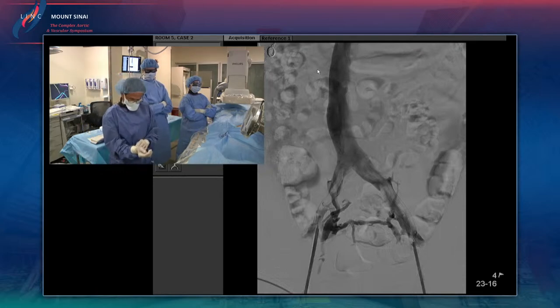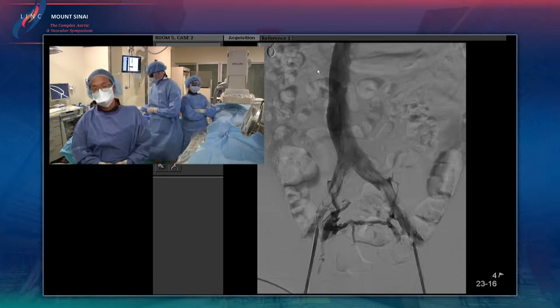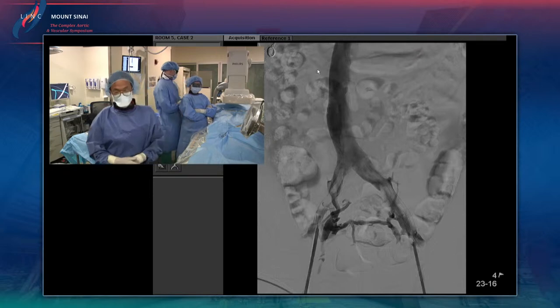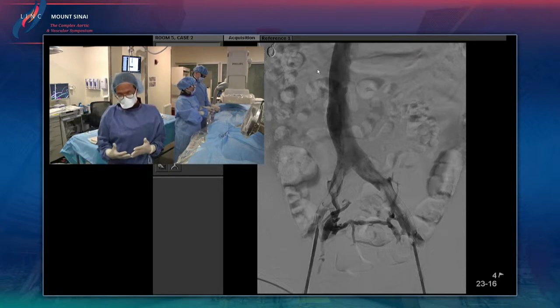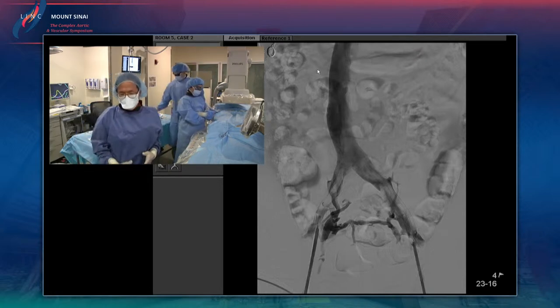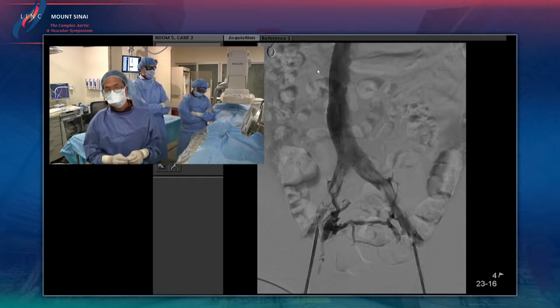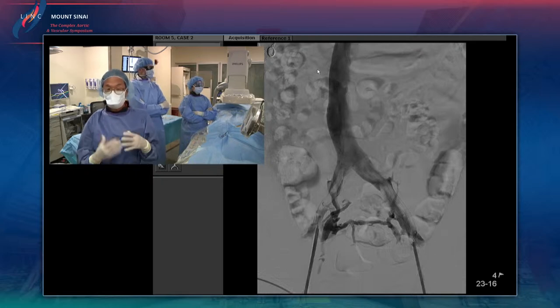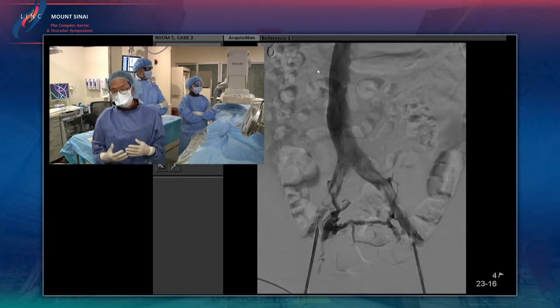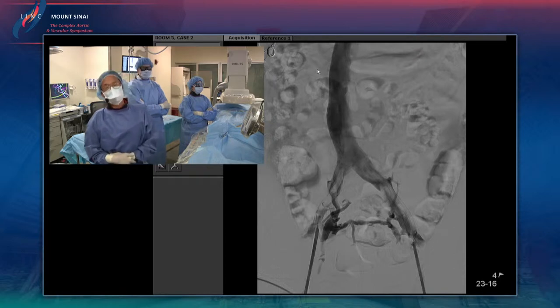So do you routinely perform intravascular ultrasound after you've performed saphenous vein ablation for your patients with leg edema and leg swelling? Is that your routine clinical protocol? No, but that's a great question. If I do laser on a patient and he comes back to me and says, okay, Doctor, my varicose veins are gone, but my leg is still uncomfortable, what do you think is wrong? Is there something wrong with the laser procedure? I know that in that particular patient, it's very likely that he may have some additional pathology, such as proximal venous outflow obstruction. So that's a patient I would do an MRI, and very likely would do venography and IVUS to better characterize his iliac anatomy.